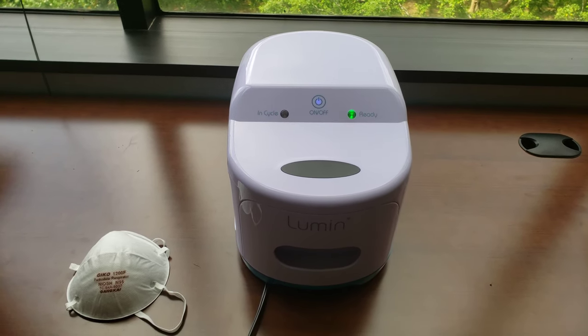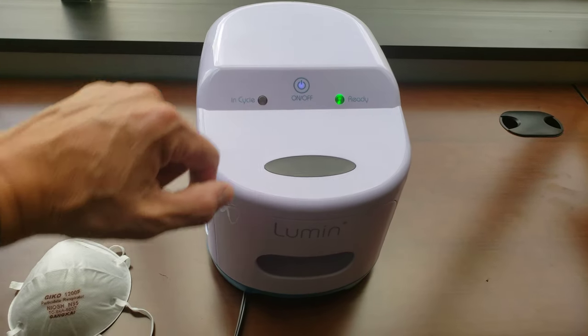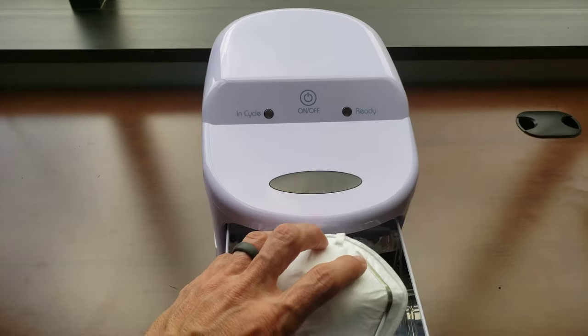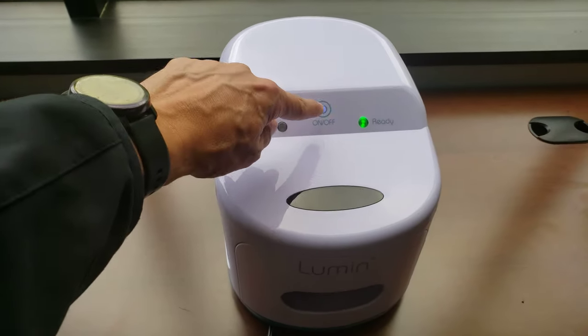It's very easy to use. All you do is plug it in, wait for this green light to come on — it says that it's ready — open the drawer, put in what you want to sanitize such as your N95 mask, close the drawer, and press the blue button.